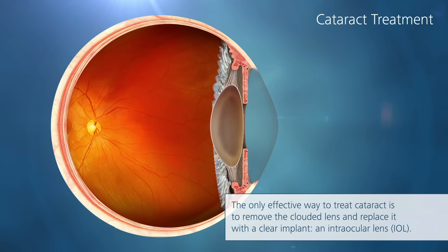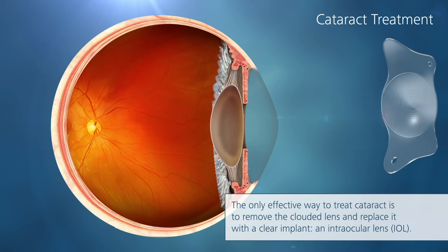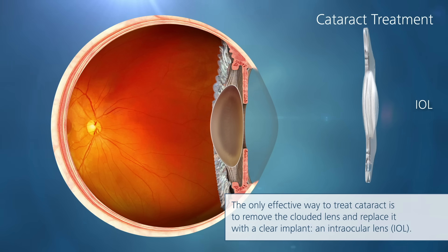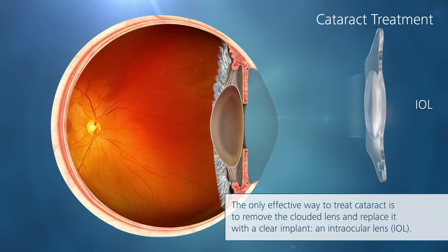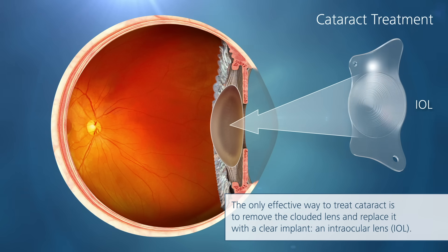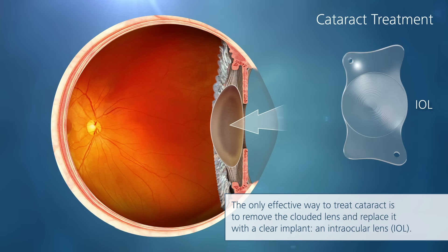The only effective way to treat cataract is to remove the clouded natural lens and replace it with a clear implant, a so-called intraocular lens, IOL.